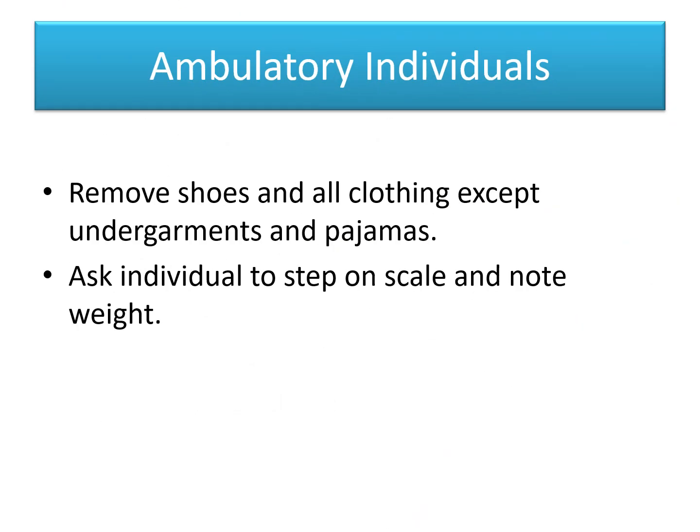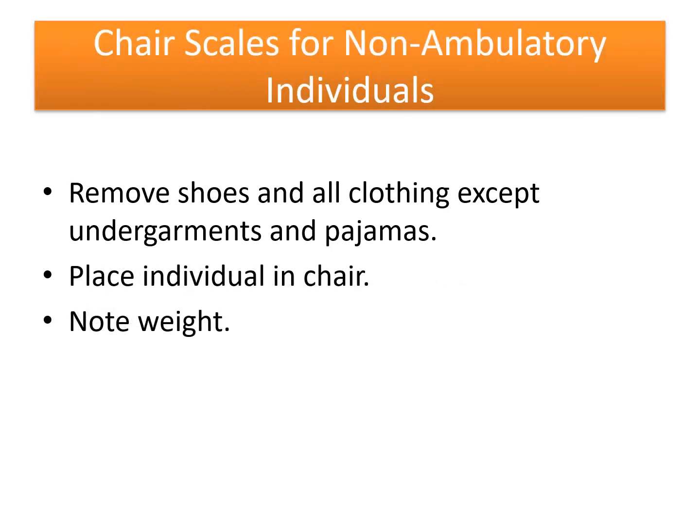For ambulatory individuals, remove their shoes and all clothing except undergarments and pajamas. Ask the individual to step on the scale and note the weight. Chair scales for non-ambulatory individuals require that all shoes and clothing are removed except undergarments and pajamas. Place the individual in the chair and note the weight.